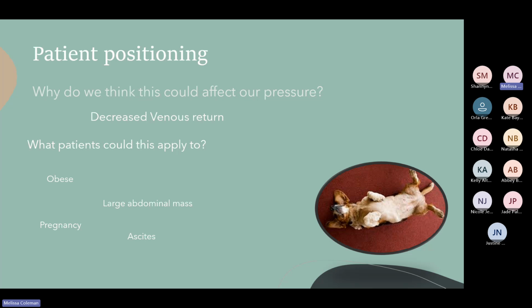So it's just really important to communicate with your surgeon. If you've got a very strange reading and then it's come back up again surprisingly, just ask them what they are doing with their hands, where their hands are in the abdomen, just so that they can be slightly mindful of it. Where would they be applying pressure to?